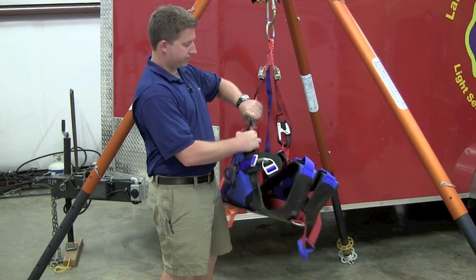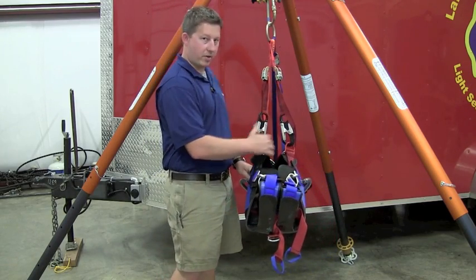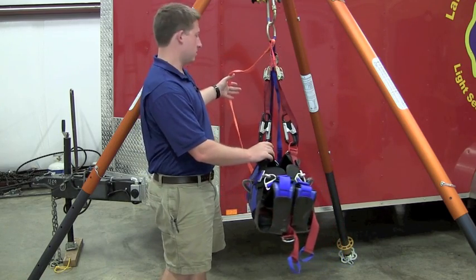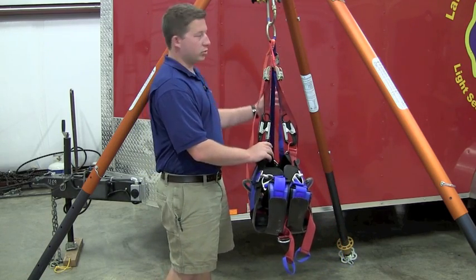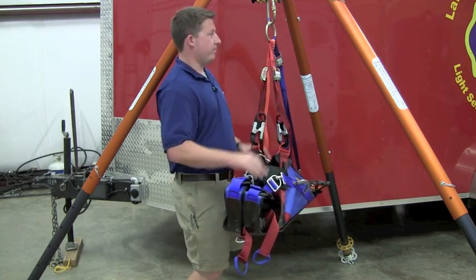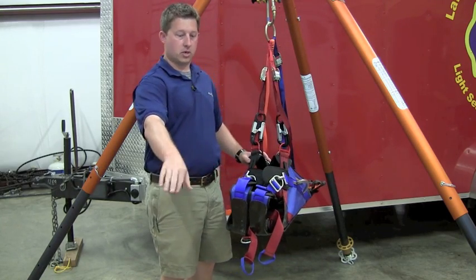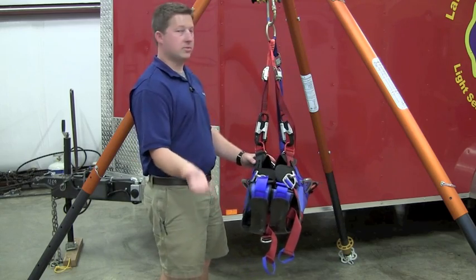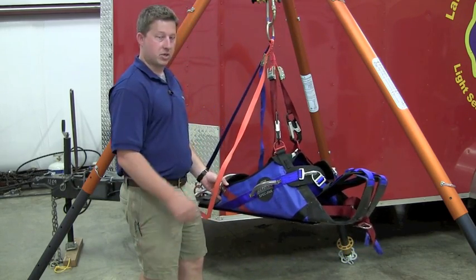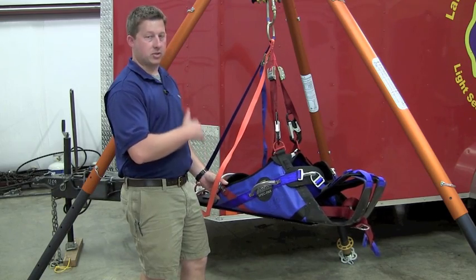But these are really easy to use, automatically locking. So there's one on each side by the hips, and then you have the orange, basically safety lanyard that goes back into the harness at the top, and then your blue adjustable lanyard goes into the head, and that's what moves the patient's head up and down. Out from the front of this is where the foot, the stirrup strap would go, and that keeps the patient's feet up.